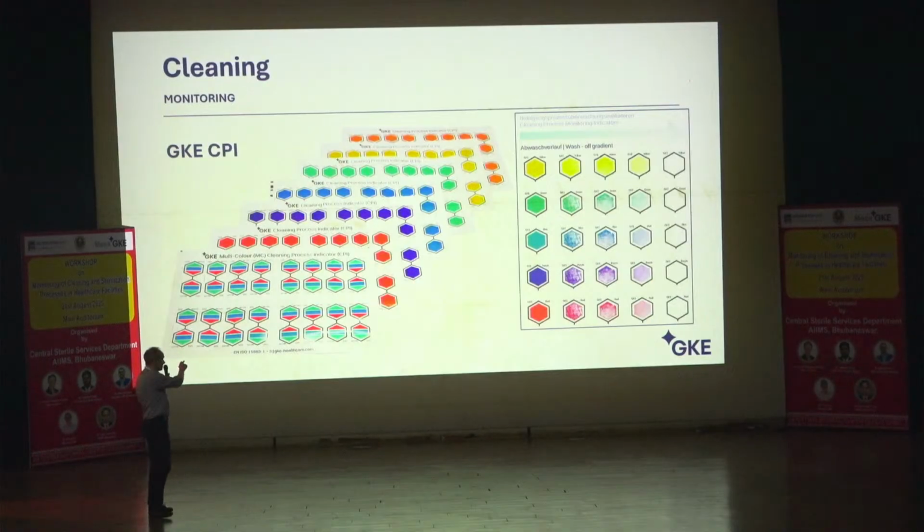So it's not the decision to take the one which you like most because it's such a beautiful color, but we would use them in a way that we test the indicators in your very cycle, and then we will decide which color would be the good one. You remember maybe the slides in the presentation before? You saw the yellow indicators being used in the hospital where we just saw information about the CSSD. Well, in this case, the yellow indicator did a good job.